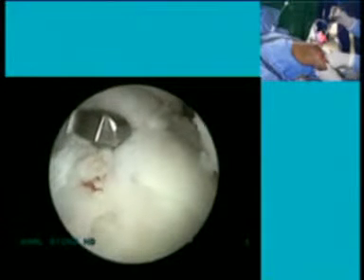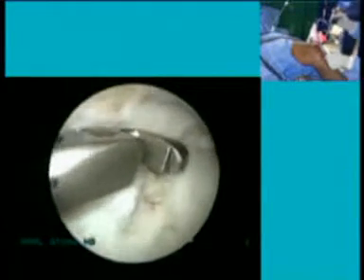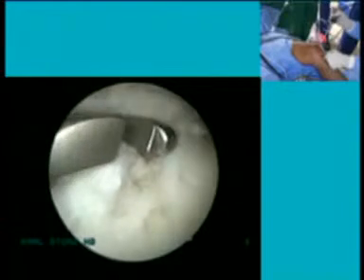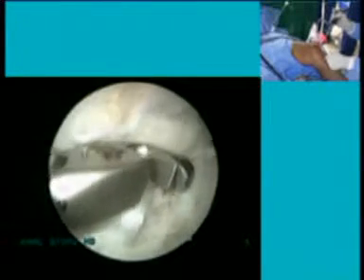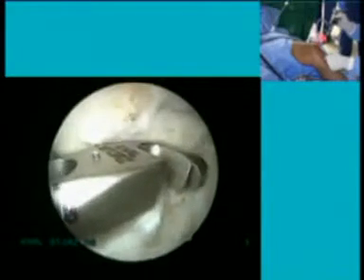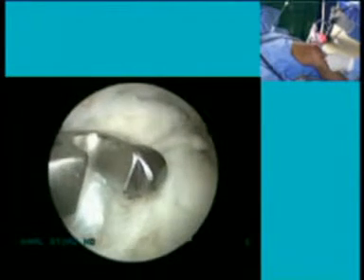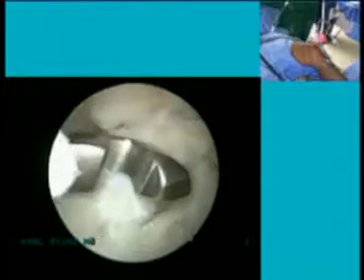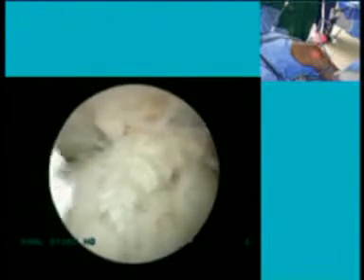Then your guide wire is not too loose. Okay. Drill, please. Look to the monitor. It's good. Stop. Stop. Broken. Another one.